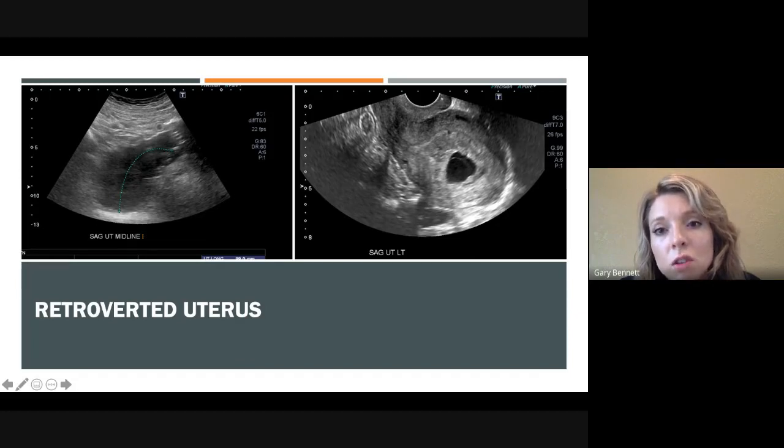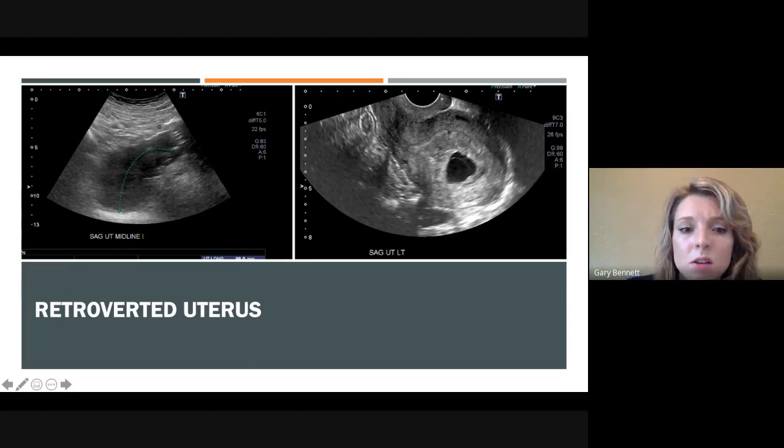So in this image, we'll see the cervix. You can see the lining right there, and then you can see the fundus wrap around. This is the myometrium, and the endometrium once we get a little bit lighter. And then we have our gestational sac right here. Looking at this gestational sac, the borders look a little jagged, but it very well could just be the slice that we obtained on that image. We'll talk about that some more later as well.